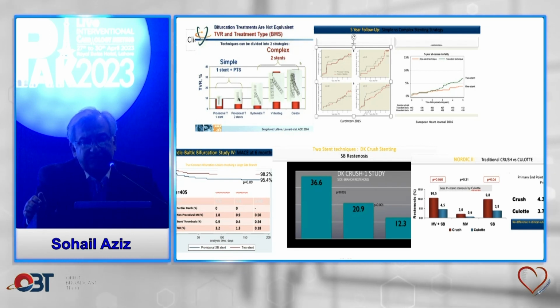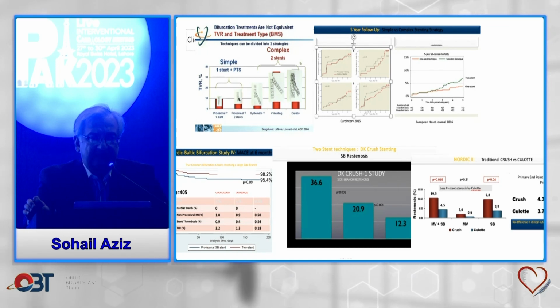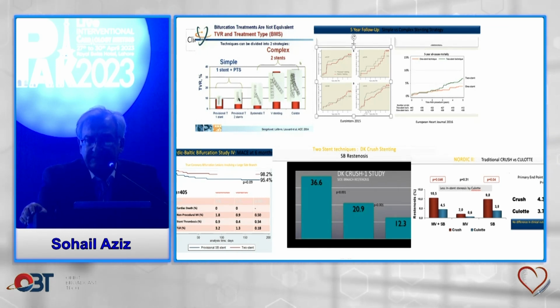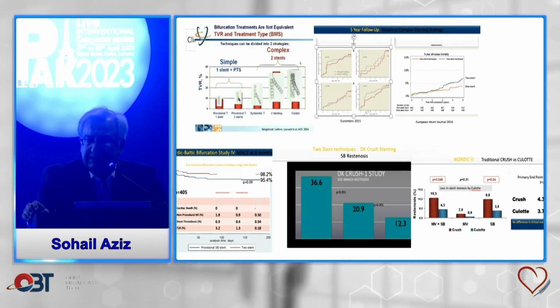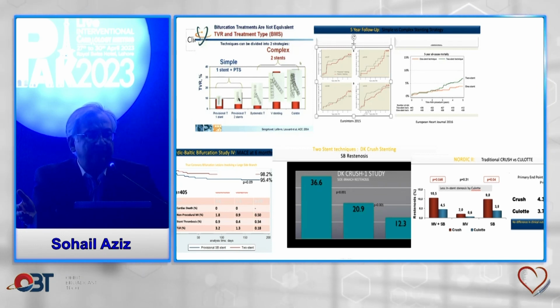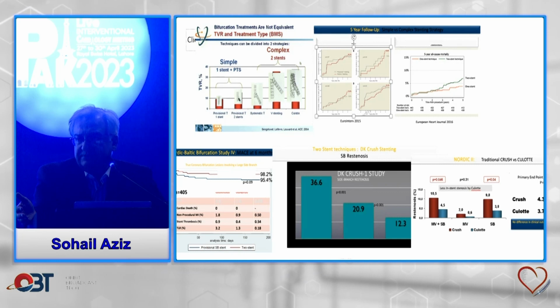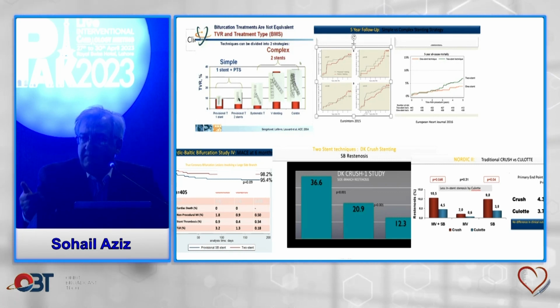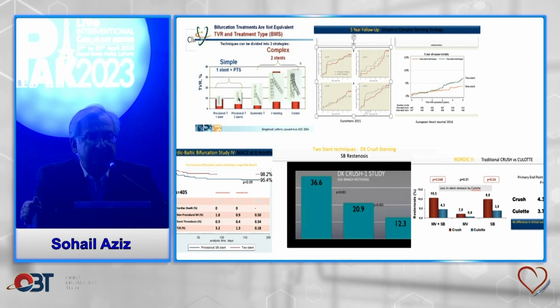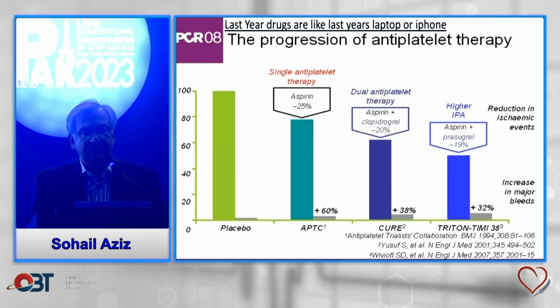One of the reasons why this is so, my concept is, that we finalized this technique so much, the distal crossings and the POT and the DOT and so on and so forth, that the stents are so well deployed. It's like what we're seeing in the TAVR business: initially when TAVR came out, people didn't know what they were actually doing. They didn't even know how to size it well. So now they've learned from the procedure, they've learned from technique. So my feeling is that if we do a proper Culotte and those things, the result would probably be very comparable.